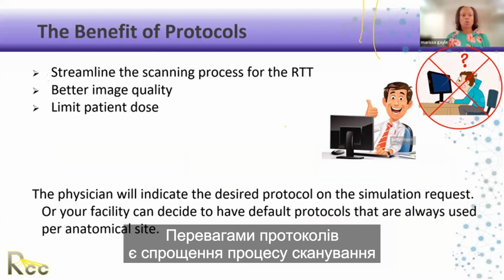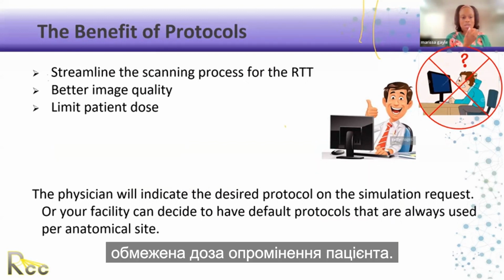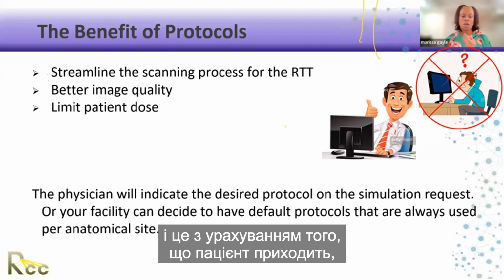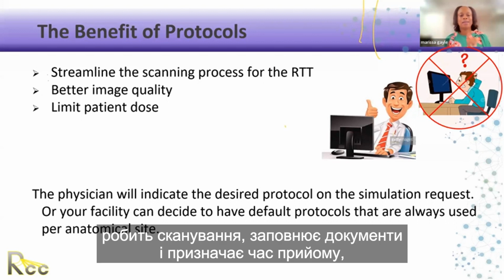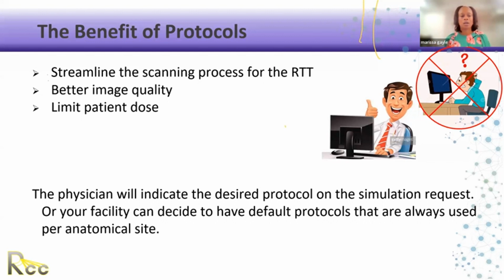The benefits of protocols is they streamline the scanning process for the RT to get better image quality, and then of course allow a limited patient dose. That's how come we're able to do our SIMs within an hour, and that's with the patient coming in, doing the scan, doing the paperwork, and getting an appointment time. Everything can be done within that hour that we allot.